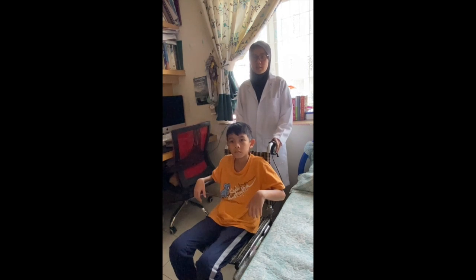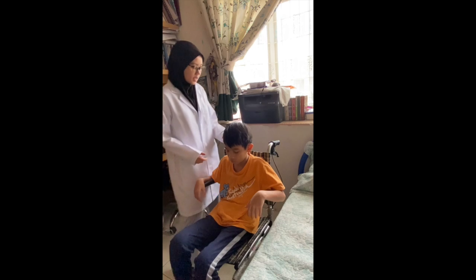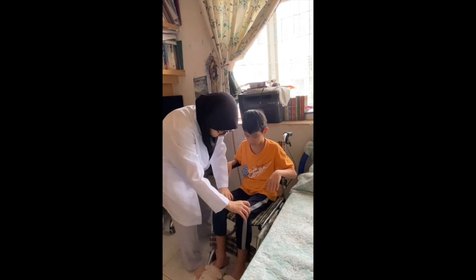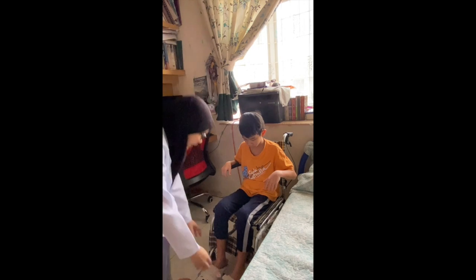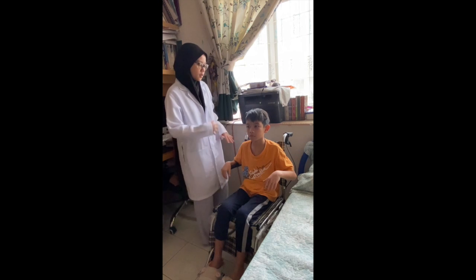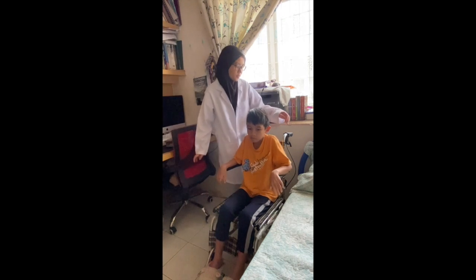The rule I am going to use is the 90-90 degree rule. It means that the pelvis should be at 90 degrees and touching the back of the wheelchair. The knees should be at 90 degrees parallel to the thighs, and the ankle should also be at 90 degrees. The patient's head should be in the middle, not going sideways. Make sure the hands are properly on the sides.